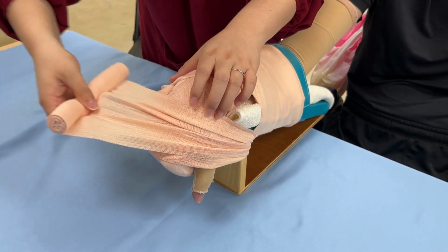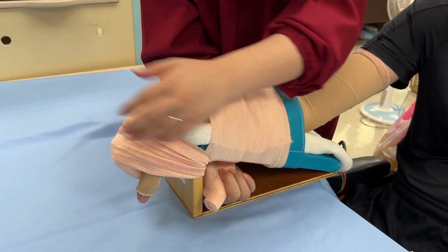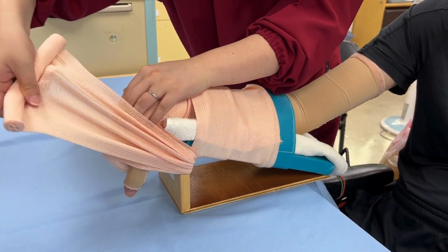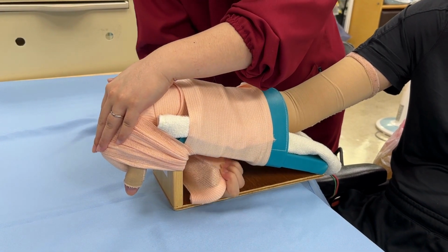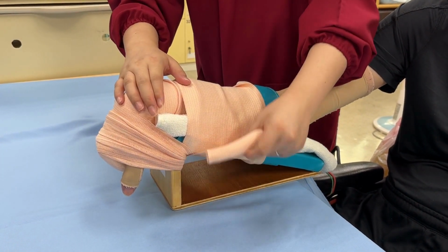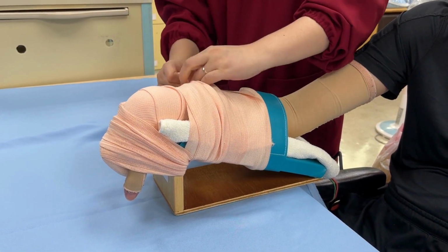Wrap the elastic bandage from the radial side to the palm, pulling the wrist in flexion. The bandage exerts tension on the back of the hand. Continue wrapping it in circles to achieve a flexion range that the patient can tolerate. After confirming that the right flexion range is achieved, secure the end of the bandage in place.